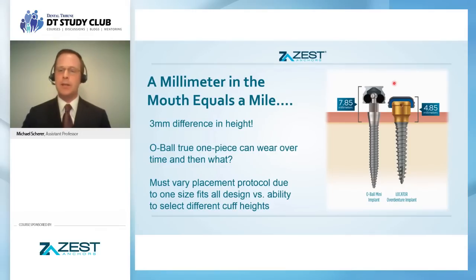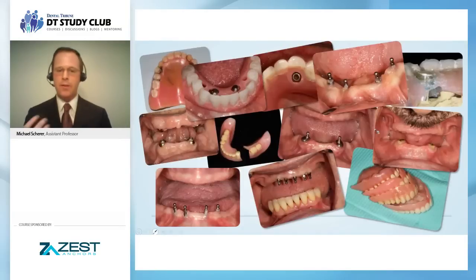And what I love about this particular implant design is that it does one thing extremely well, which is an implant overdenture implant, as opposed to a jack of all trades. Now, unfortunately, this is one of the things that I see in my clinical practice here in Las Vegas. I get to evaluate a lot of problems associated with implant overdentures, and this is just a small snippet of the problems that I see in my current position. What we see is just inaccurate treatment planning and lack of respect of prosthetic space.